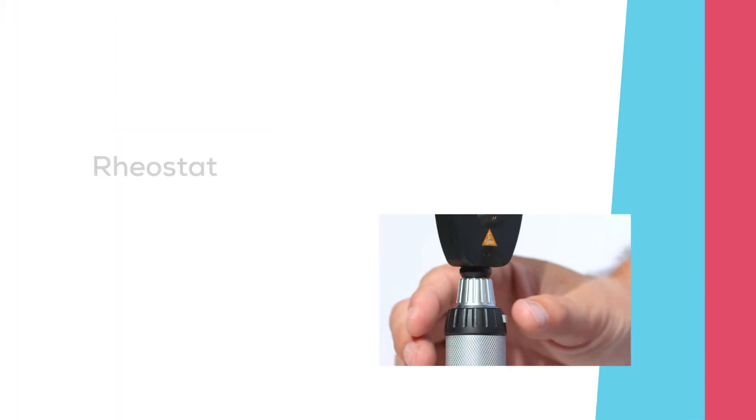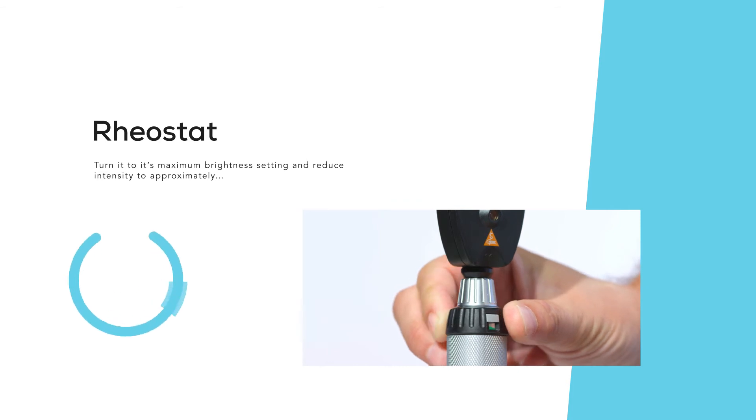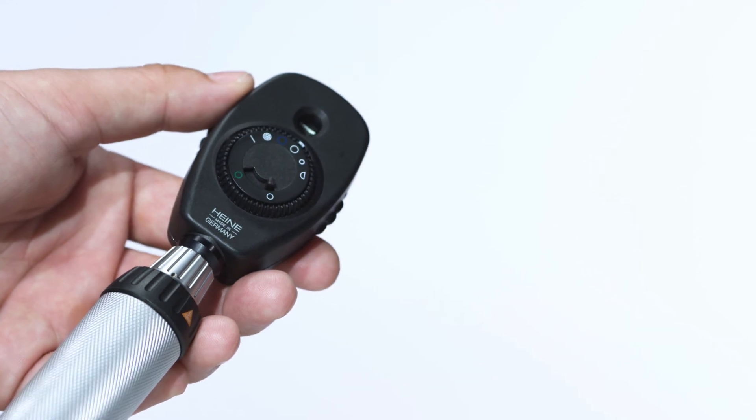When performing an examination with the Beta 200 ophthalmoscope, turn the instrument on by pressing and twisting the rheostat to the left. Then turn it to its maximum brightness setting and reduce to approximately 75% intensity. Then select the aperture needed, utilizing the easy-to-view aperture legend.